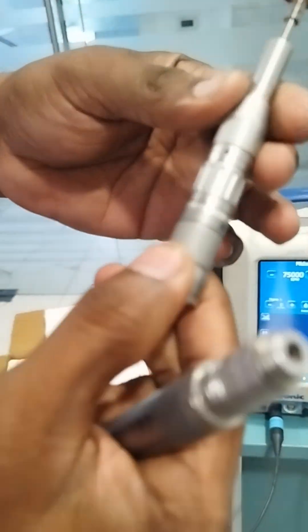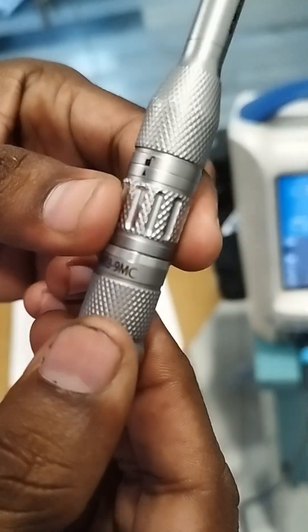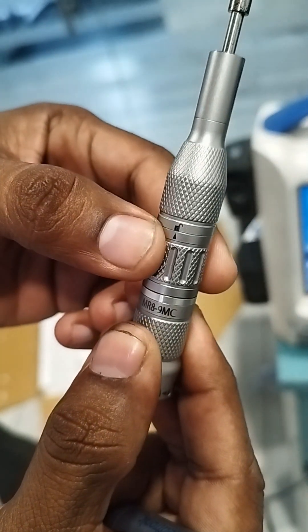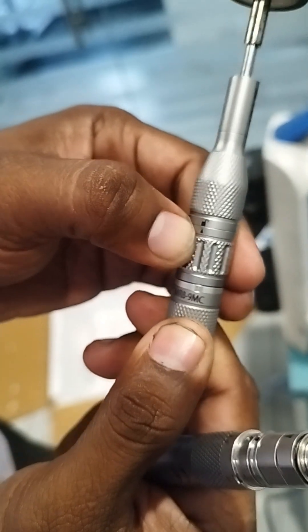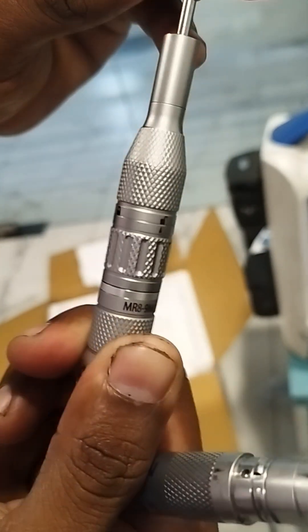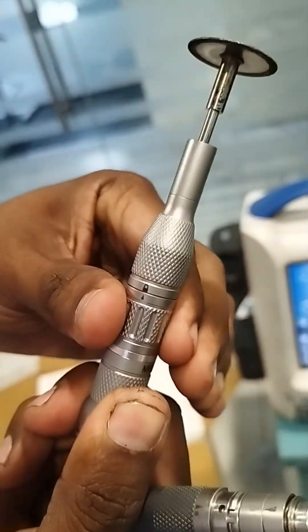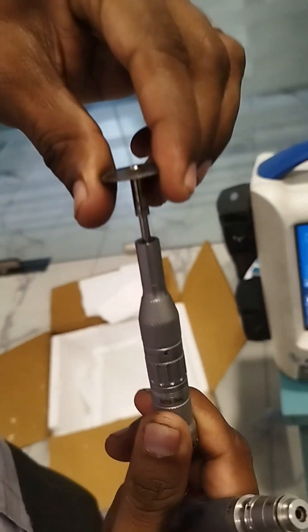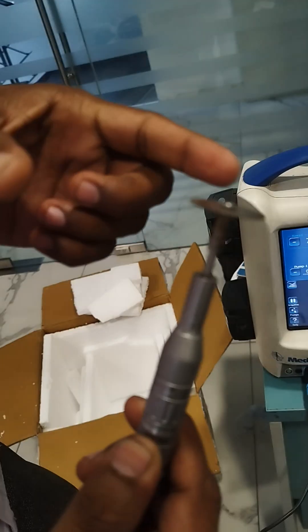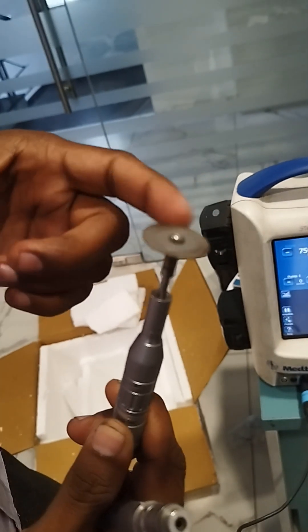Before that, you need to see the locking and unlocking symbols here. This is the unlock symbol and this is the locking symbol. Initially it should be in the unlock position — the arrow mark should be at unlock. Then press the tool, rotate it, and lock it. You can see it is now locked, and after locking it will rotate freely — meaning it is perfectly locked.